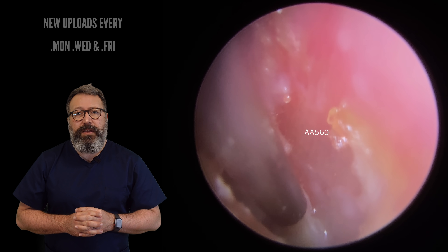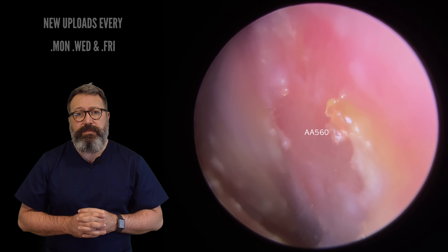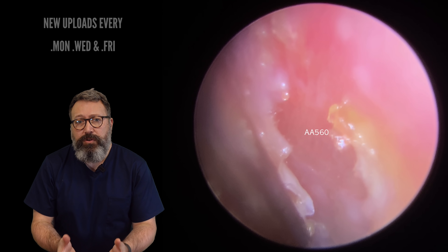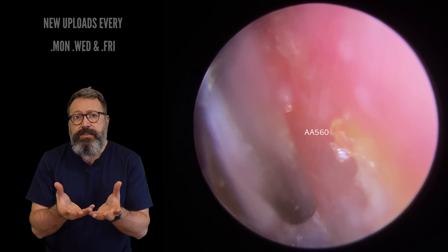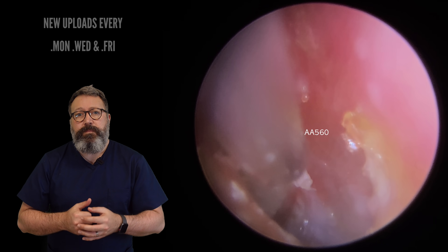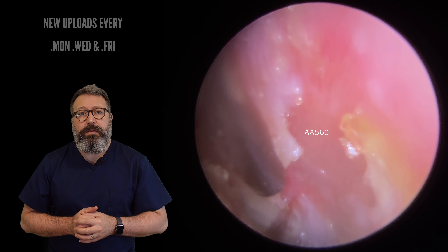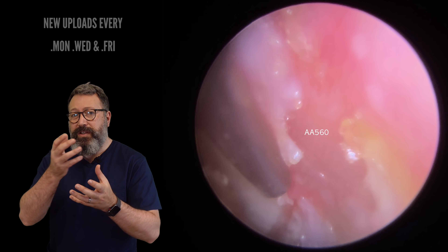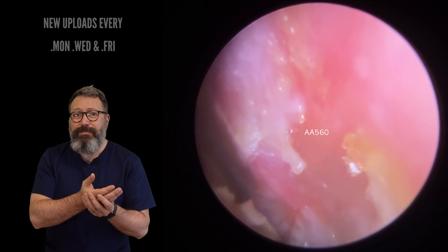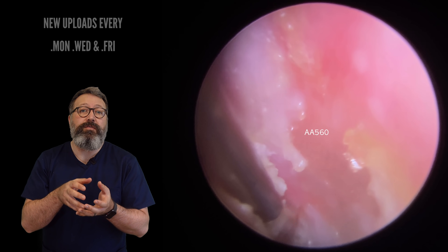We've got this layer just at the base here that needs to come away, so let's start peeling some of this very gently — I'm not on the eardrum here, I'm just literally just in front of it. You can see how that bottom section starts to lift now, and we'll get this next section coming away. See how it starts to peel now? What you're seeing there is actually the eardrum underneath, but there's so much scar tissue and dead skin built up on there.